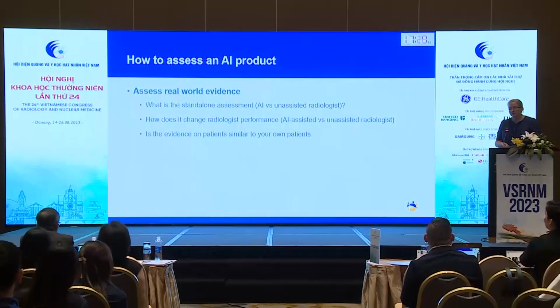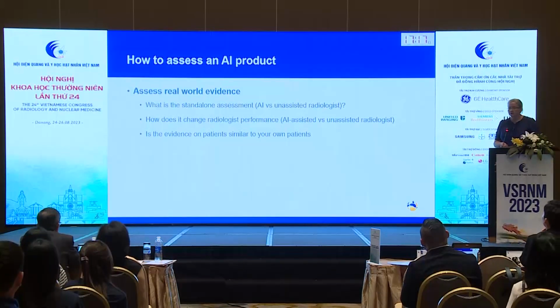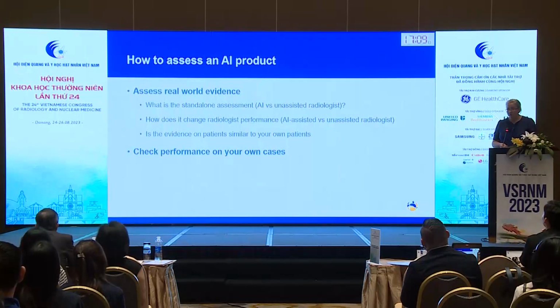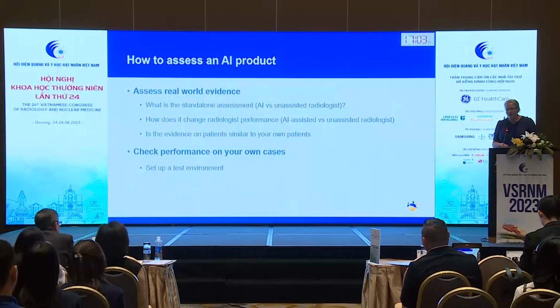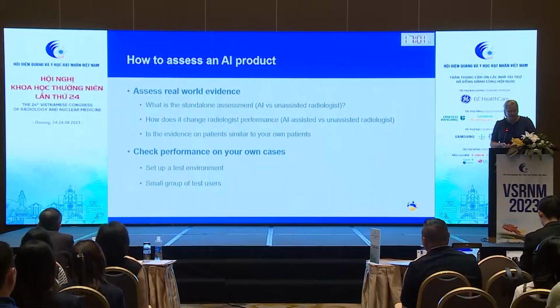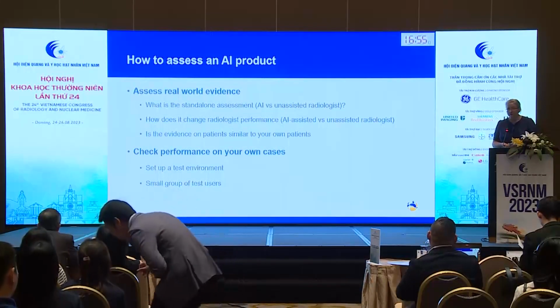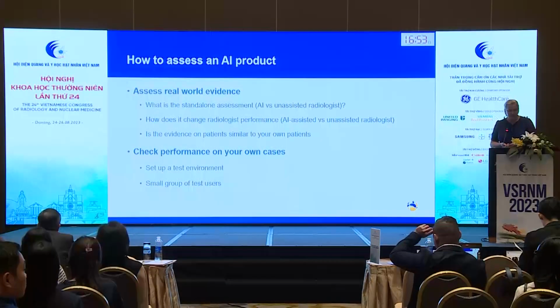And check to see whether the evidence has been generated in a patient group that is similar to your patients. You should check the performance of the AI on some of your own cases. You should try to set up a test environment to check that it will work in your own IT infrastructure, and have a small group of your own doctors test it to see whether this is something that will be beneficial for your department.